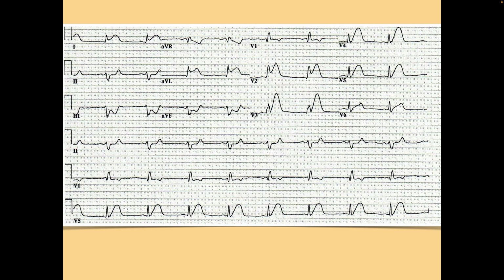So, the hyperacute T waves, when I say measure from the J point, here's the J point here. About how many millimeters is that particular T wave from the J point to the top? Remember, each large box is 5 millimeters. Like 15. How much? 15. I was going to say 13-ish, but we're close. So I guess 15-ish is good.